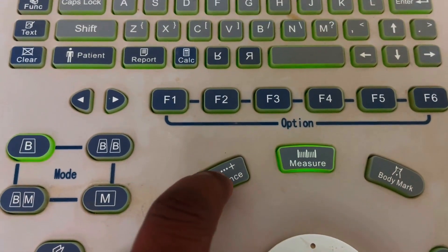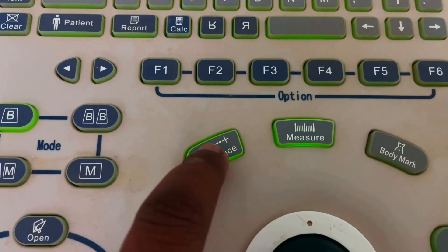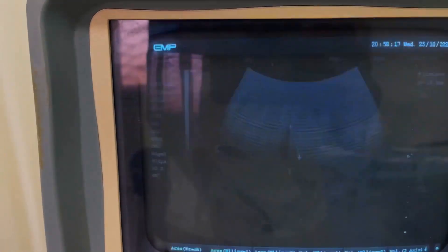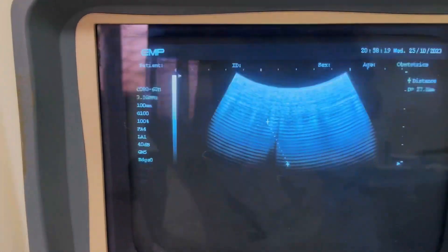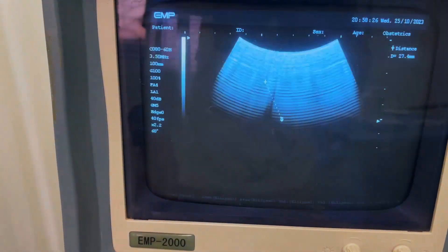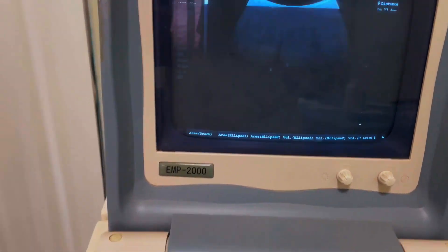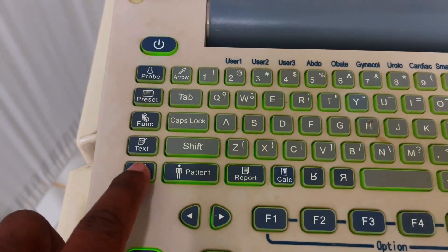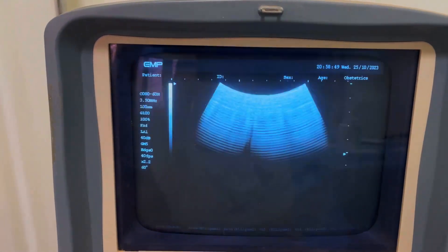This one is the distance button — you can use it for measuring distance. This one is the set button or OK button. You can set a point by pressing this button. If you want to clear this from the screen, just press the clear button and nothing will be seen on the screen.